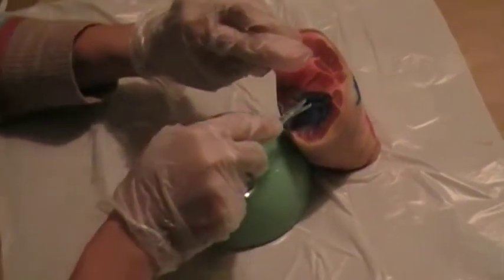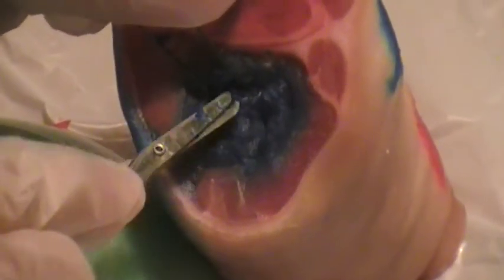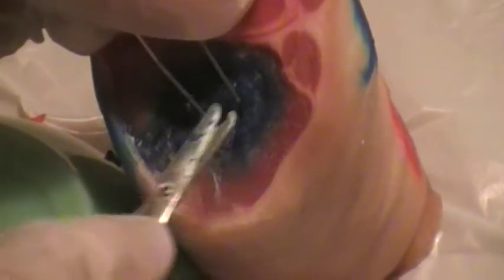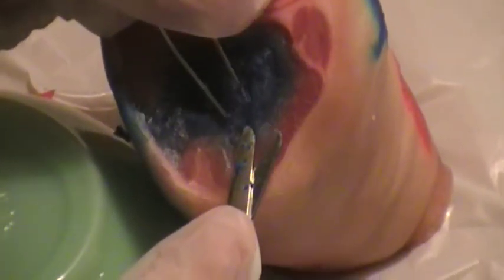So this is a few minutes later. I've done a bit more debriding on the inside, not trying to get too close to the edges. And as you can see, it's a lighter blue — it's still pretty dyed. And I don't want to go too much further in case I get off the dyed tissue.